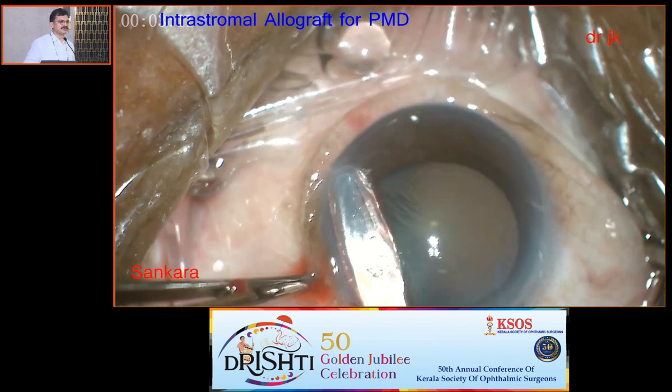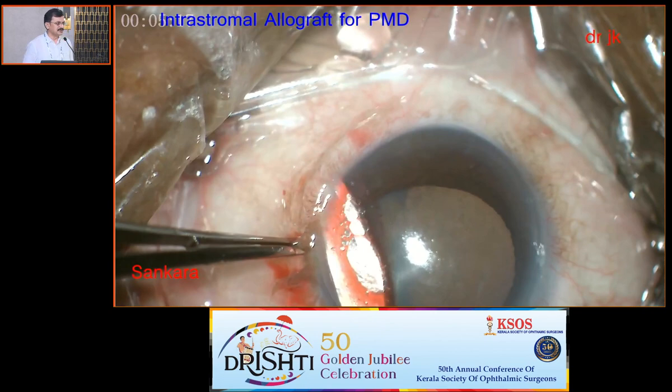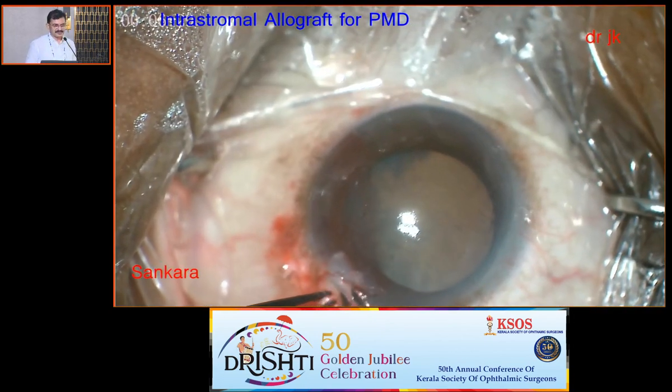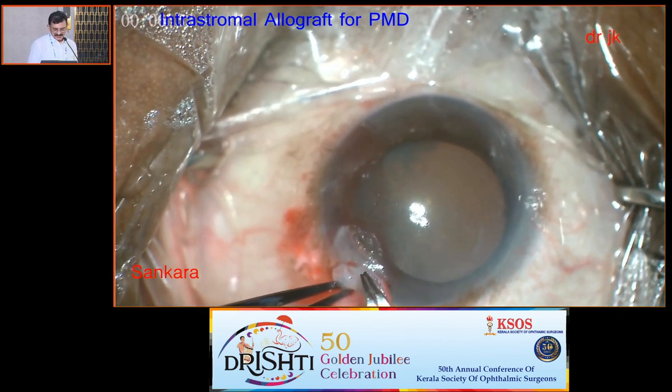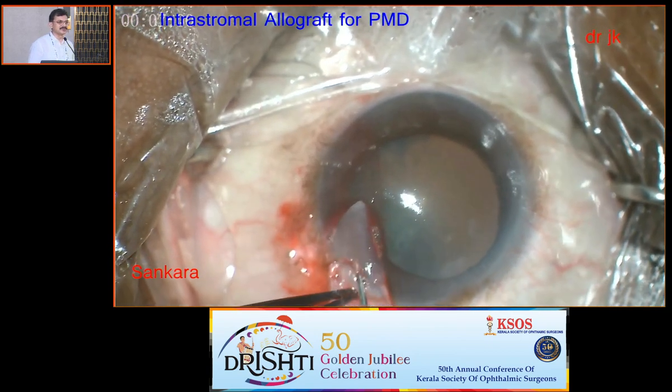It should be a little bold. You should be a little younger. Not 40, 35-year-old people can easily do it. Not at the age of 67, 65 like me, 60 years. Then put a small lenticule there. You fashion a lenticule and put it, and this is a cure for PMD.